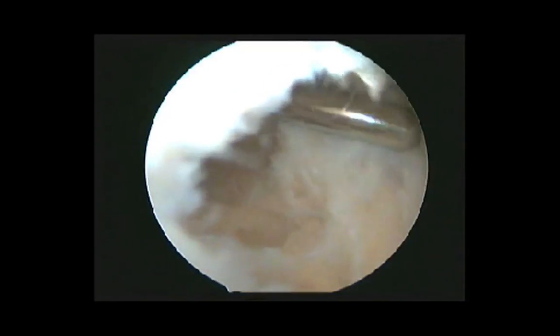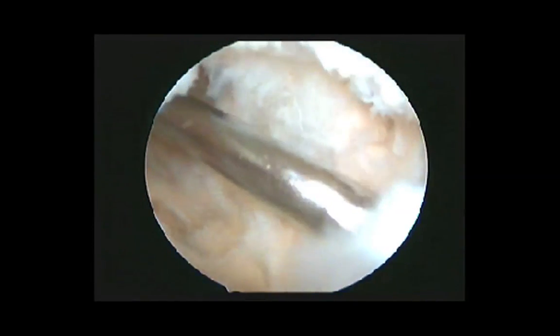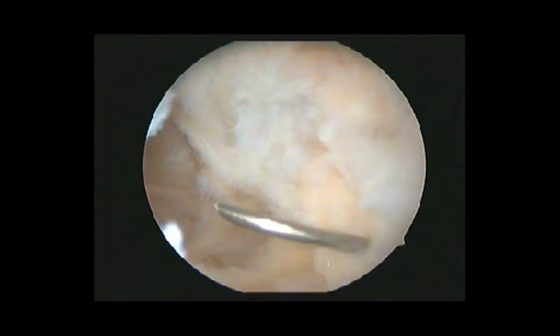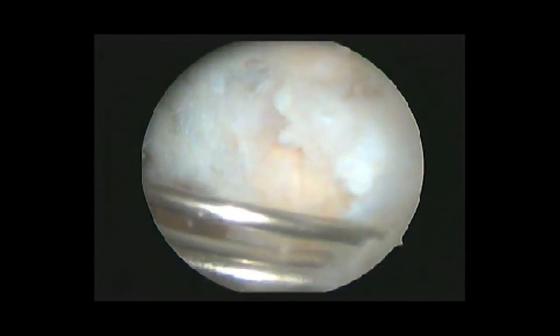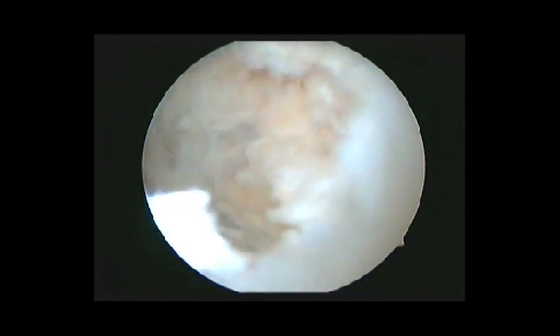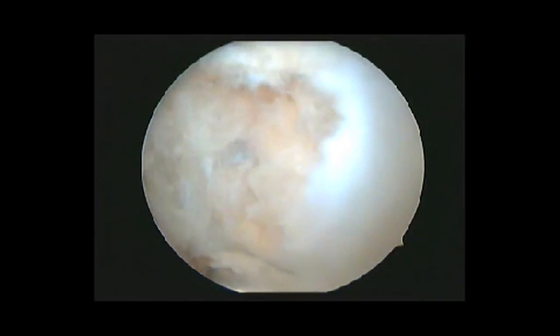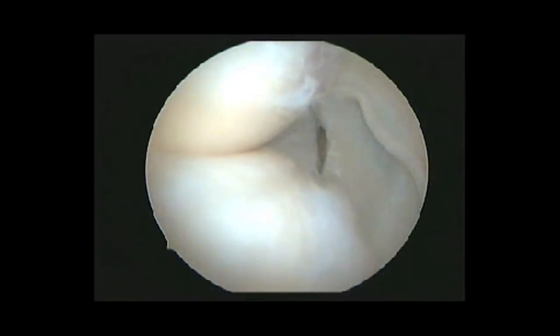The posterior midline septa of the knee is now clear of the cyst wall. As you can notice, the shiny normal capsule is visible on the posterior aspect of the midline septa. After satisfactory debridement from the posterior medial portal, we had to create a posterior lateral portal, for which a spinal needle is passed first, followed by a Visinger rod along the axis of the spinal needle, over which a 5 mm cannula is once again passed. We generally do not use these cannulas for the whole length of surgery, but they create a track which makes it easy to pass the following instruments.